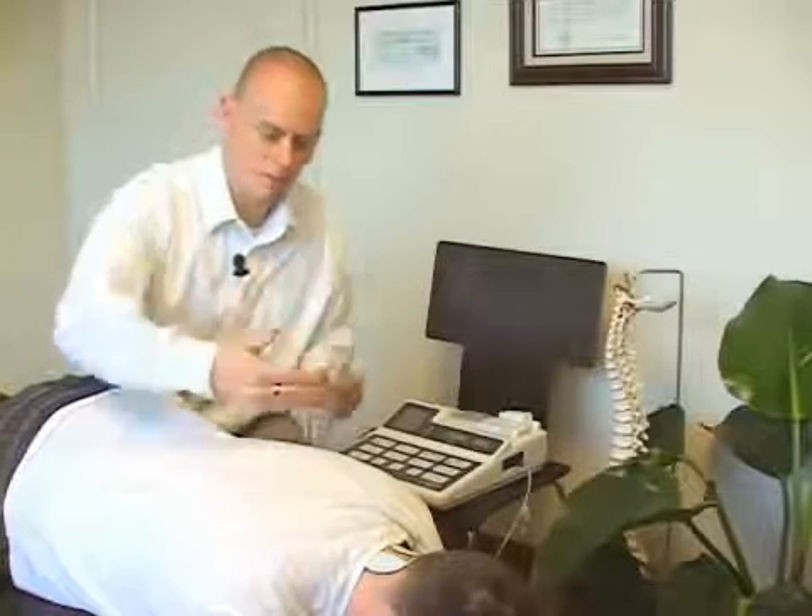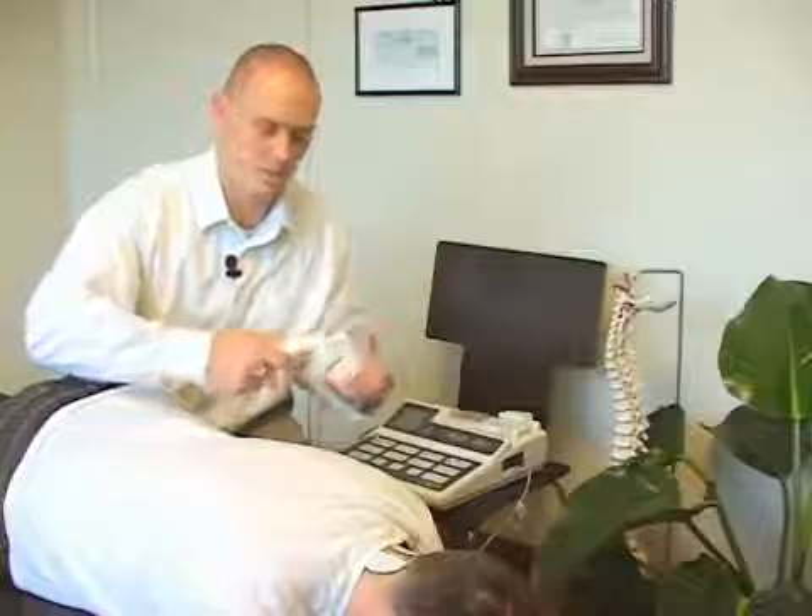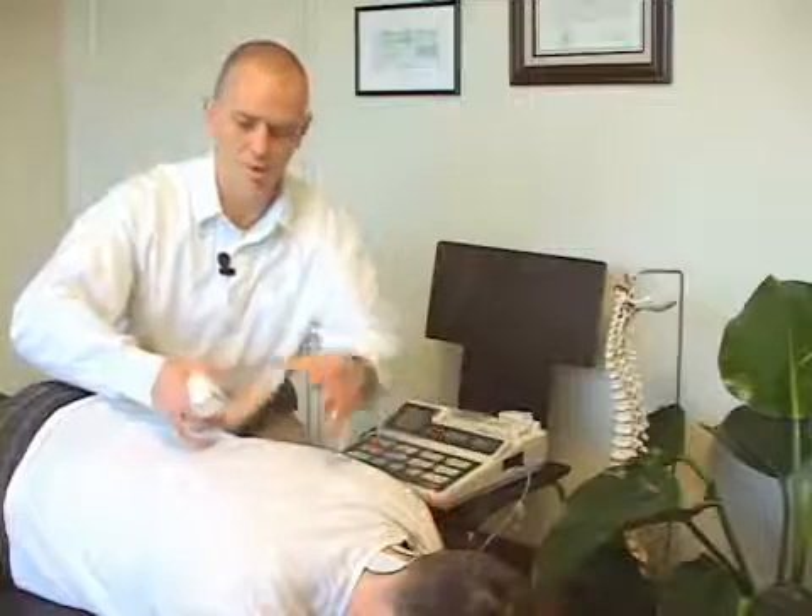The point of ultrasound is a deep heating therapy, which helps to reduce muscle tension in those areas. If someone is very acute, we're not going to use this, because heat and acute situations don't go well together. But if someone is very chronic or subacute, we can use this to help promote further healing and muscle relaxation. It just complements the adjustment nicely.